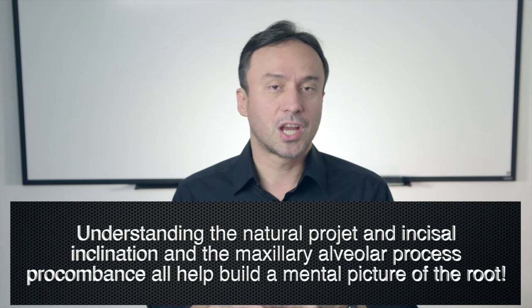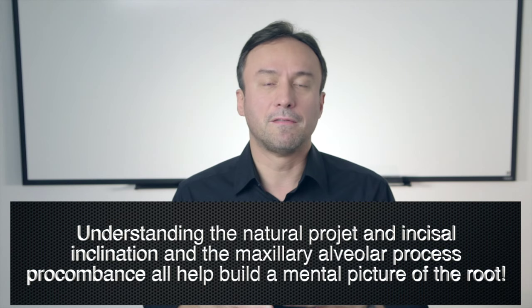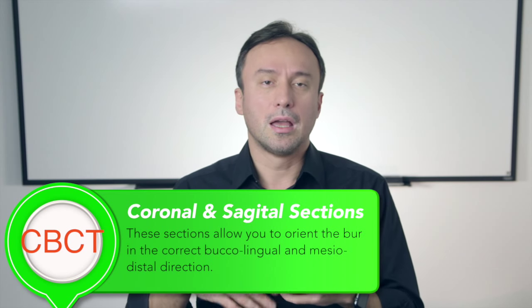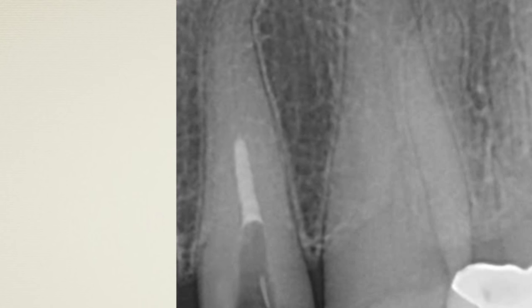This lets me know as I move forward whether I'm heading in the right direction, so I can correct course. This obviously only gives me information in the mesiodistal direction — I could be off in a buccal-lingual direction — but I address that by looking at the overall orientation of adjacent teeth, palpating the root in the buccal-lingual direction, and building a visual model of where the root might be in the bone. I keep injecting BC sealer, move on, use ultrasonic and water to quickly wash it out, then go further and inject a little more. Sometimes the sealer gets into the canal and you can actually see the beginning of the root canal, making it fairly easy to find at that point.